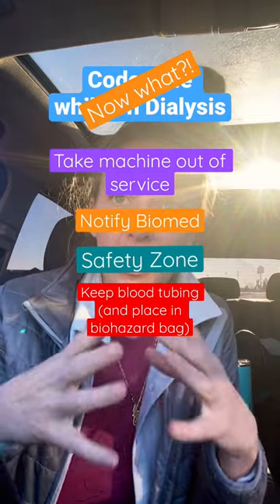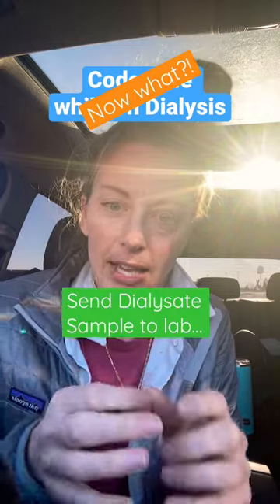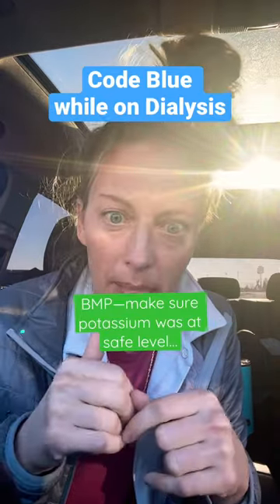You're going to put that in a biohazard bag. You're going to send a sample of the dialysate — put it in a green top or a yellow top — and send that to the lab.